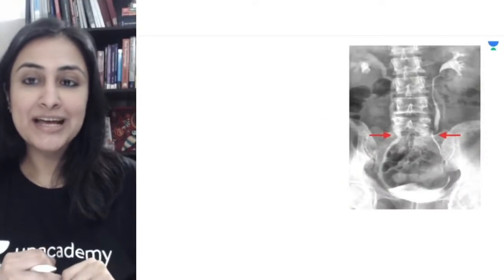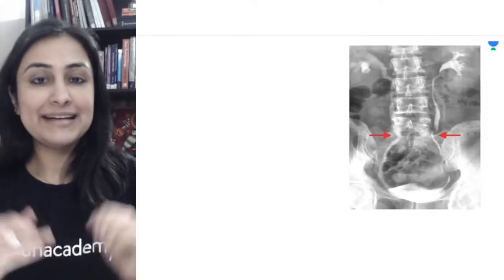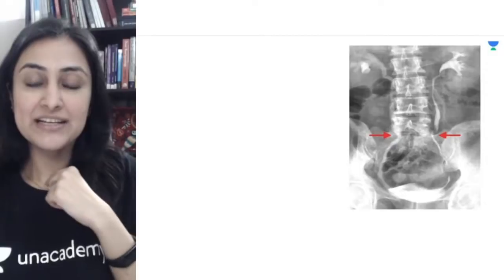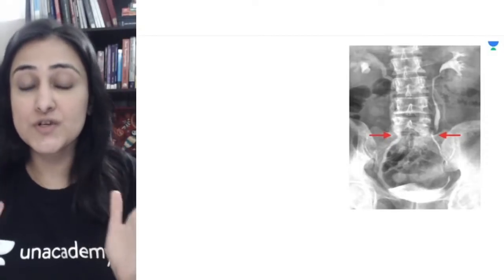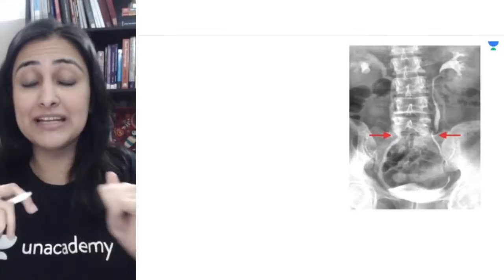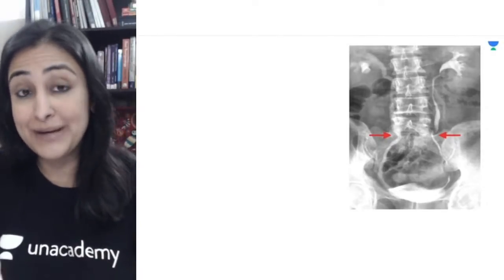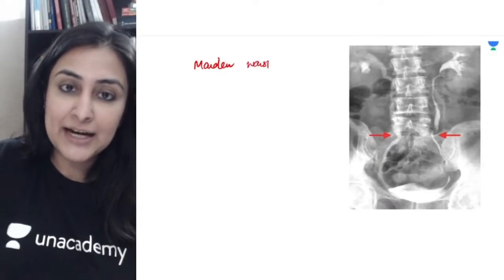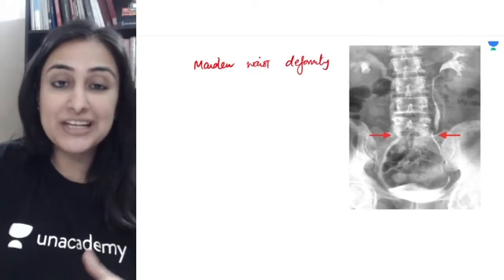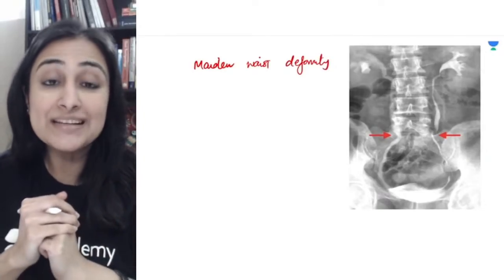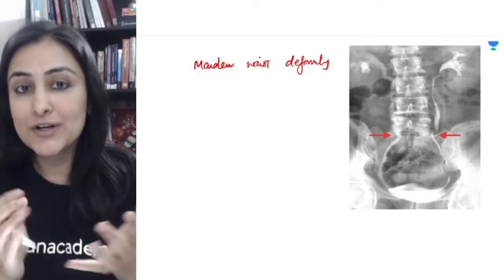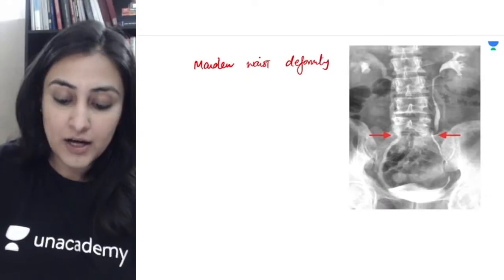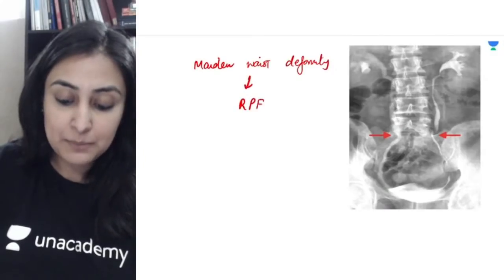Next image: the arrows show that inferiorly toward the inferior part of the ureters, both ureters are approximating each other. This appears like a maiden waist — a very narrow waist. This maiden waist deformity is associated with retroperitoneal fibrosis, which is pulling the ureters closer to each other medially.